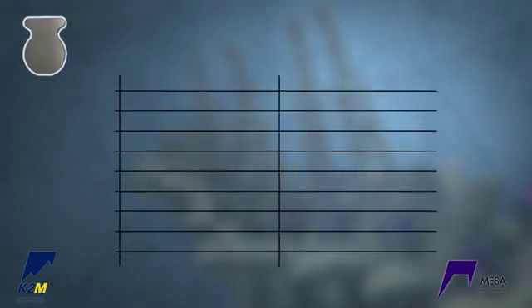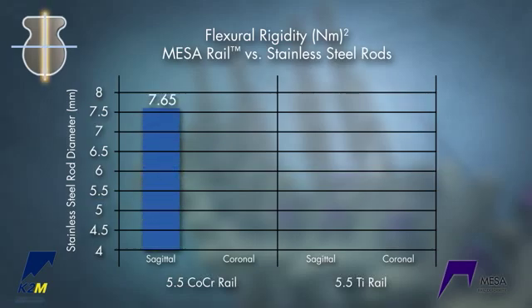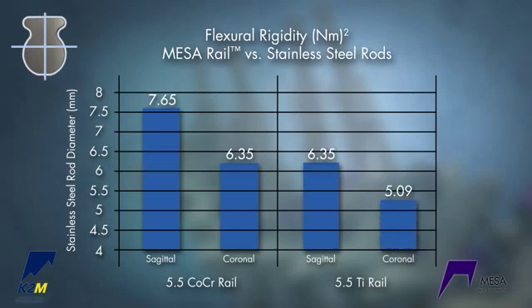The shape of the rail makes it stronger than a standard rod, but it can still be used with the same MESA Deformity screws. A 5.5 cobalt chrome rail is equivalent to a 7.65 stainless steel rod in the sagittal plane and a 6.35 rod in the coronal plane. A 5.5 titanium rail is equivalent to a 6.35 stainless steel rod in the sagittal plane and a 5.3 rod in the coronal plane.